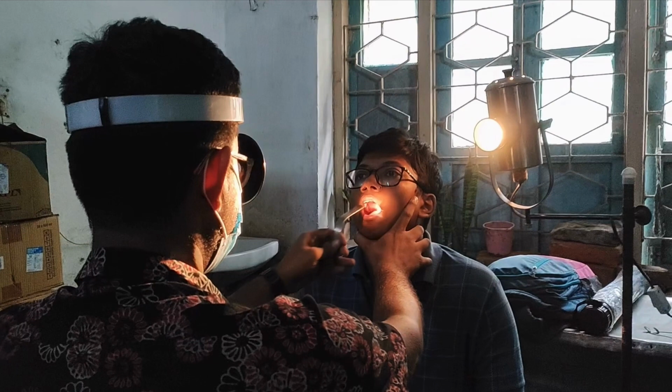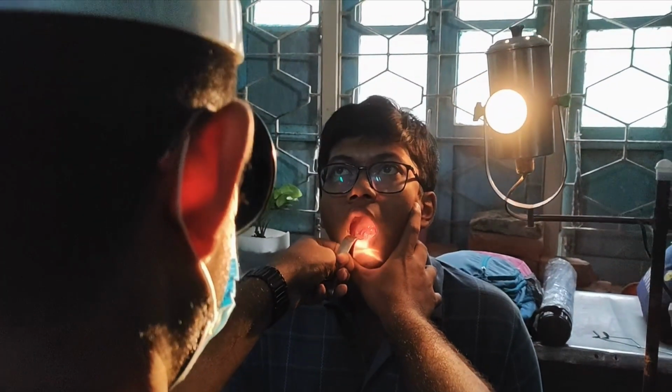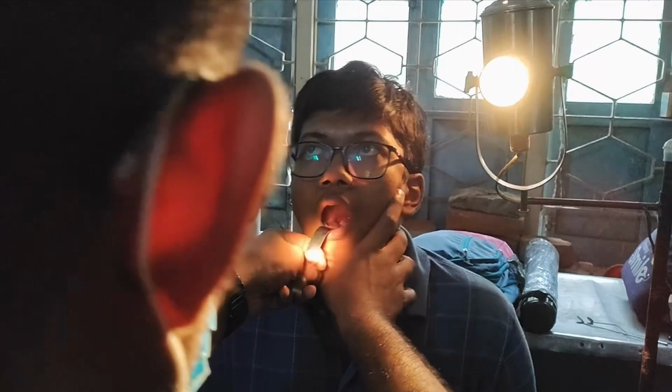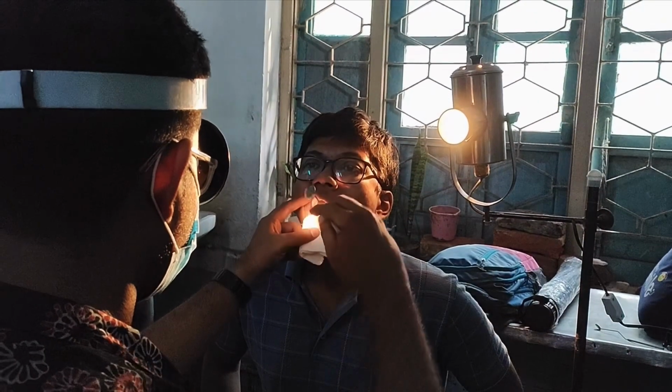Now I'll show you how to use a tongue depressor to examine the oral cavity, the tonsillar fossa, anterior and posterior pillars, and the posterior pharyngeal wall, and even to see the palatal reflex, palatal movement. When you are depressing the tongue with the tongue depressor, it is important to stick to the anterior two-third so that the gag reflex is not initiated. There is no gagging of the patient because I have only depressed the anterior two-third with the depressor. You can see the tonsillar fossa on the right side, see the uvula, and I am asking the patient to move his palate as well.